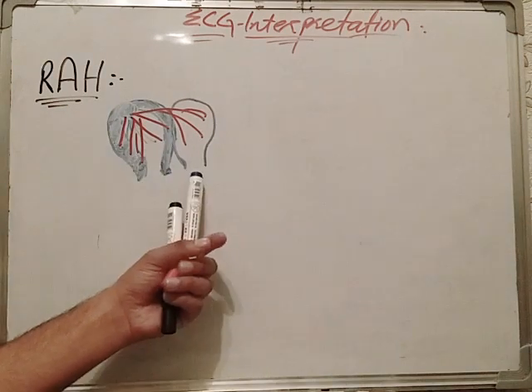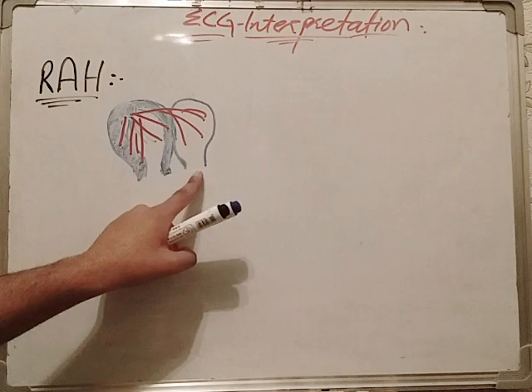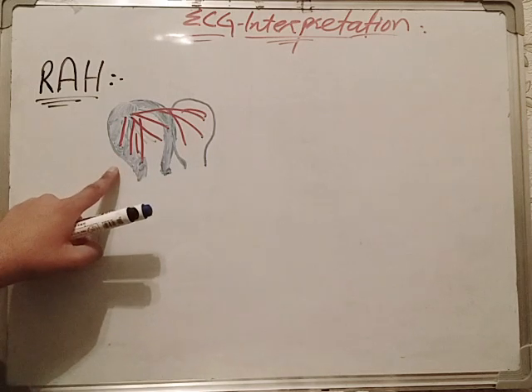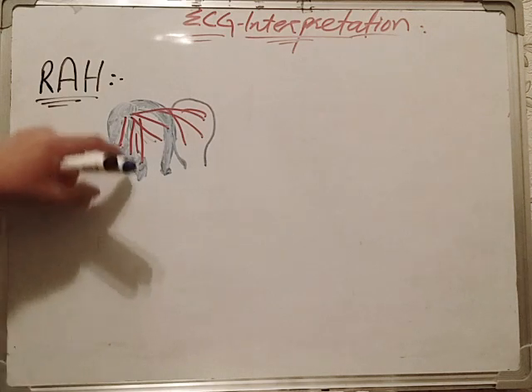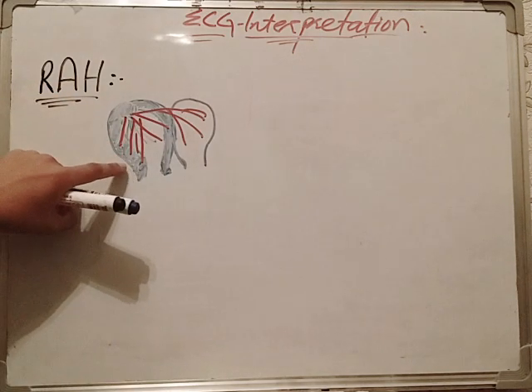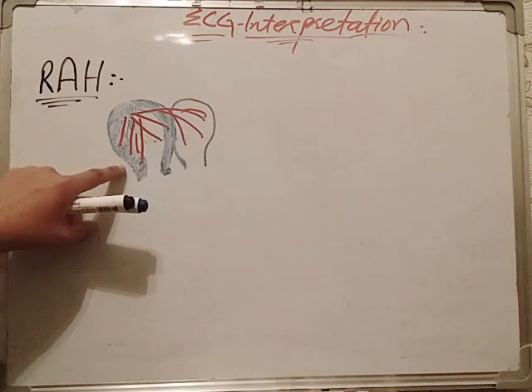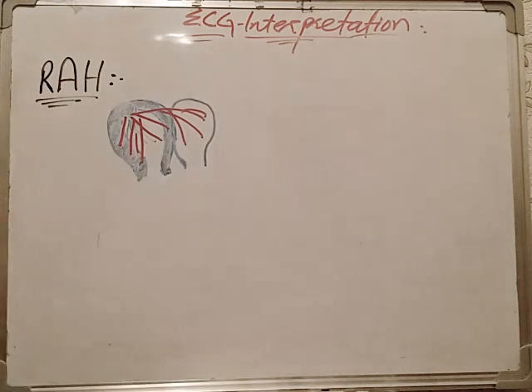As the left atrium is working normally, it will not show any changes in its wave, but the right atrium will show some changes because it becomes thick. So the depolarization in this area will be of high amplitude. It will not take much time. Why? I will discuss.